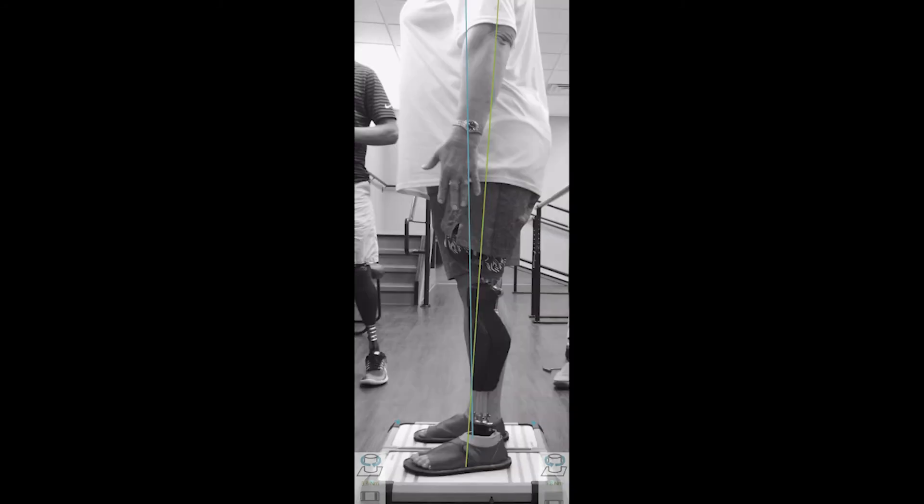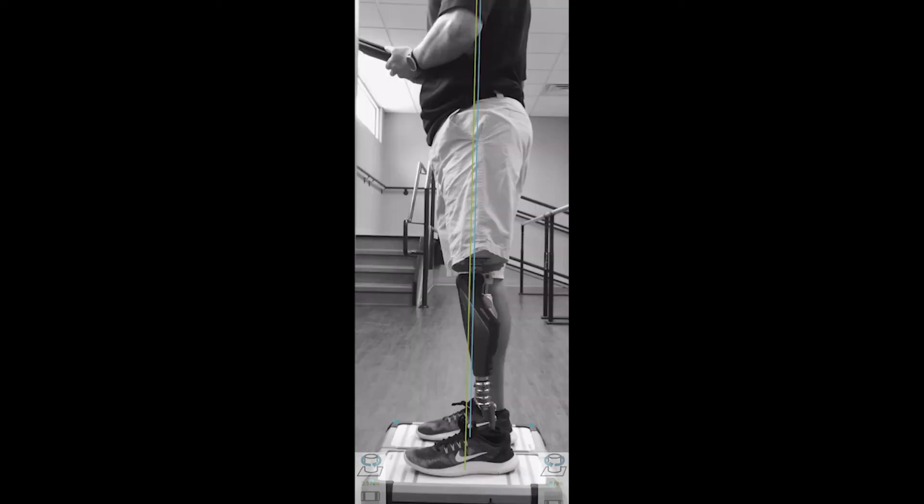Here you can see that the lines originate from roughly the same point at the foot but then diverge as they run towards the head in different directions. This tells us that we should look at the flexion or extension of the socket. If the patient were left in this alignment, it would cause the knee to be less stable and it would have a tendency to bend involuntarily. This last image is an example of lines that are parallel but not overlapping — the prosthesis is not pushing the patient forward or backward, but we may need to look at the alignment of our components to see if we have proper placement either anteriorly or posteriorly.